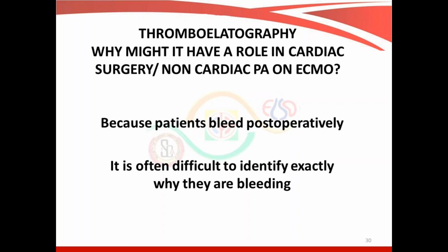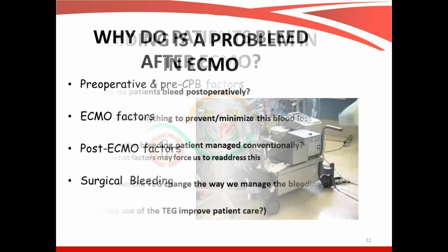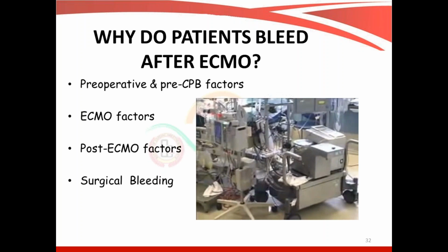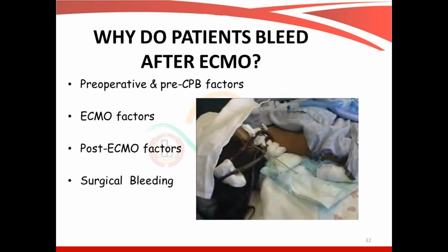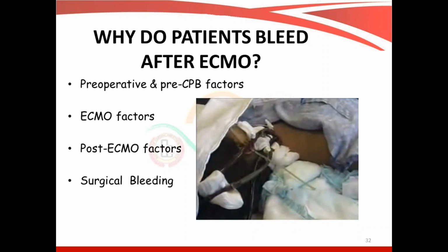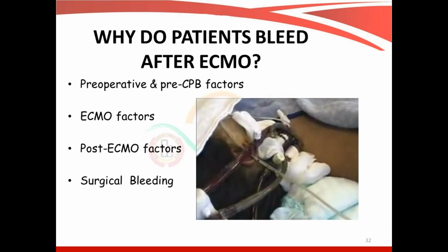And why do these patients bleed? Because these patients are on a heparin infusion. How is bleeding managed in these patients? These are some things that TEG resorts to. I'm talking so much about this because for the last 1.5 years we've been using, in fact, one of our machines permanently kept as a research project in the form of a Rotem, which is a modified TEG, in one of the OTs where we do most of our tests on patients who bleed.